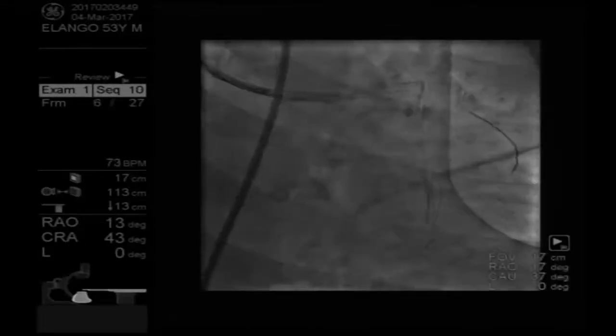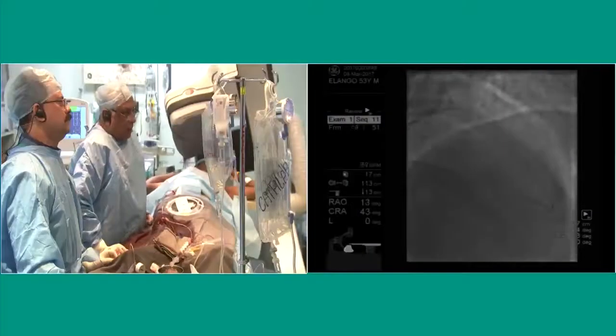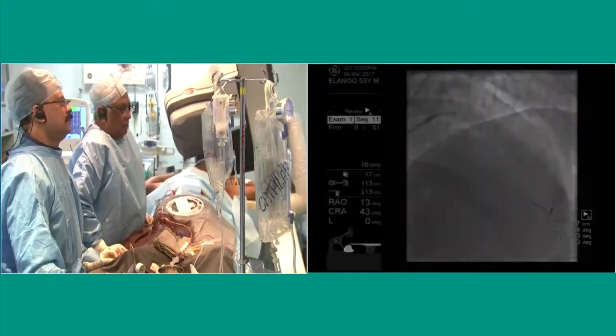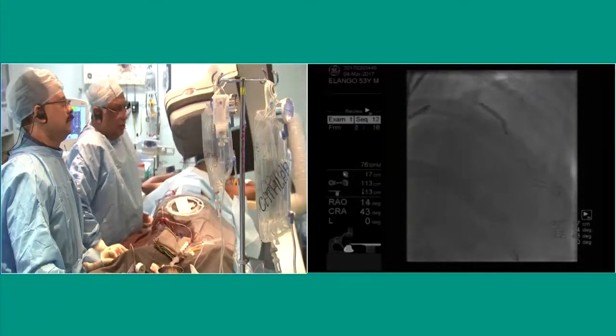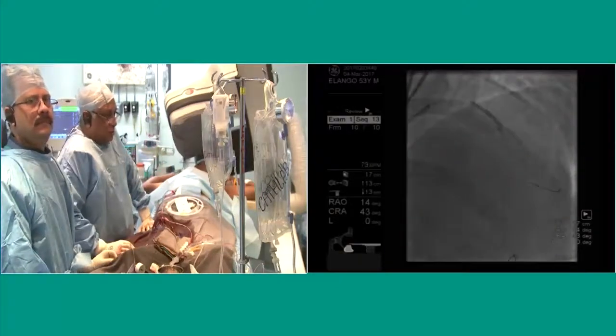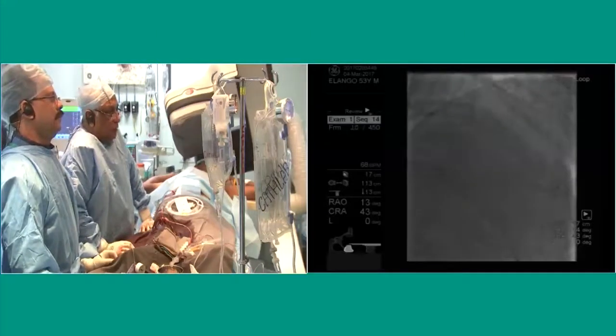After we finished the rotational ablation, we prepared the lesion. And then we took an Alpine 2.5 by 23. Next, go forward. Previous picture. Back. As I said, because of the profile and the trackability, the Alpine tracks so well, even though there was calcium there. Next. And delivered the stent. Next. Post-dilated proximally a little with higher pressures, using the same balloon because we are going to stent proximally anyway.